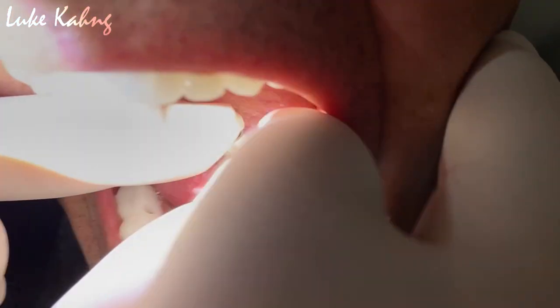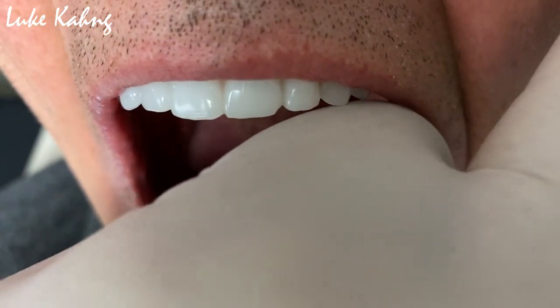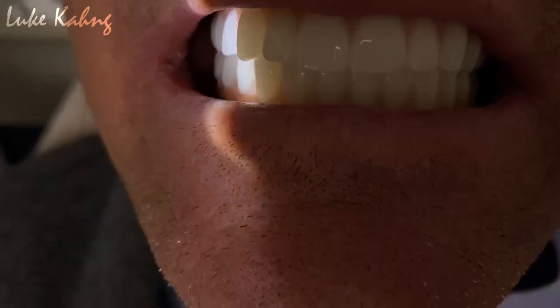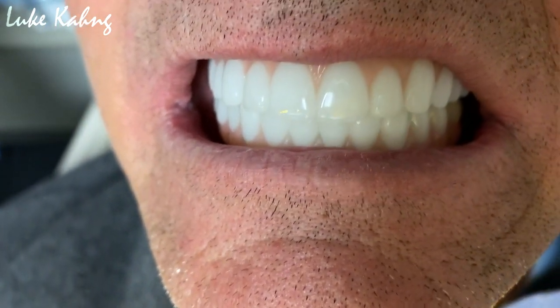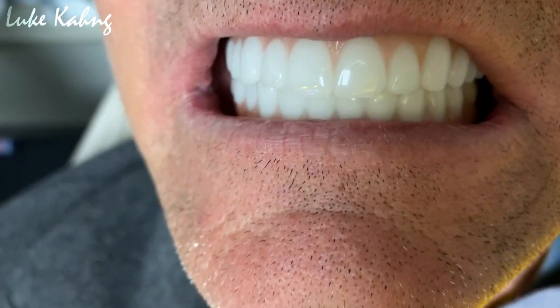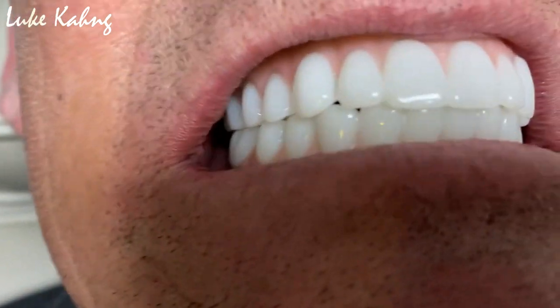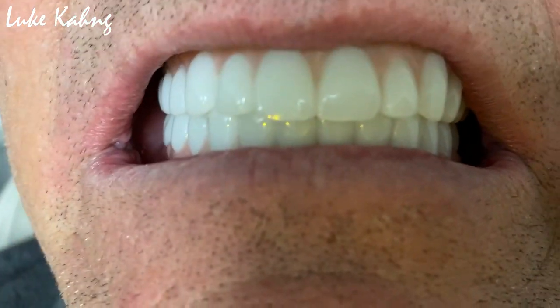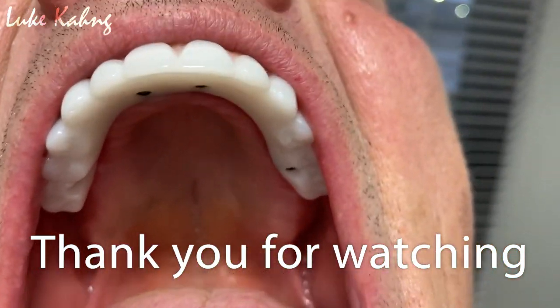And this is the angle one. Try to put the printed pieces in. Can you gently bite? That's cool — this is temporary, just so you know. Look at this bite, see? Yeah, love it! This is what you want. Open up. Yeah, this is temporary. That's cool.